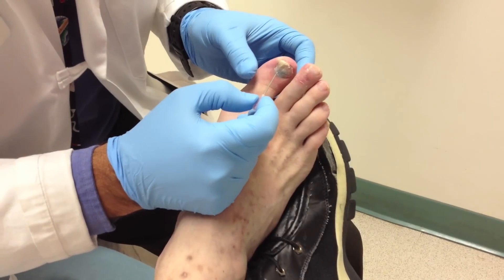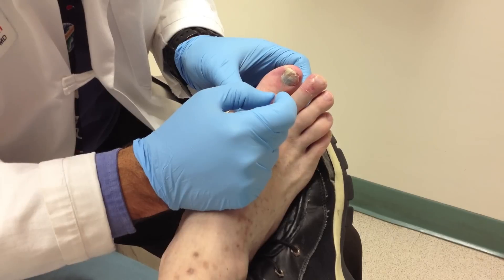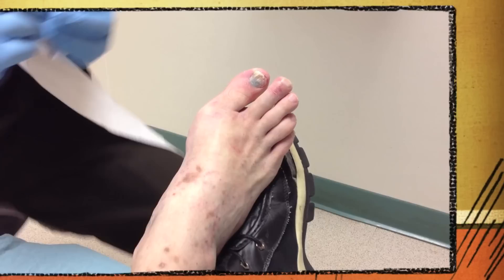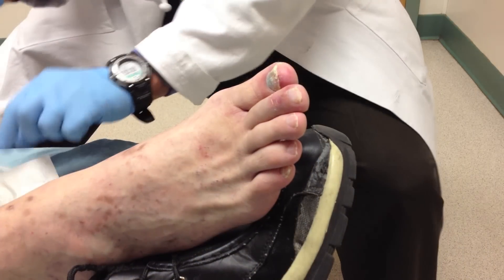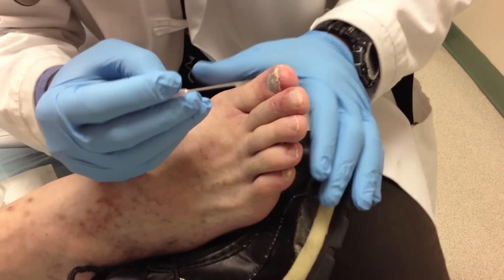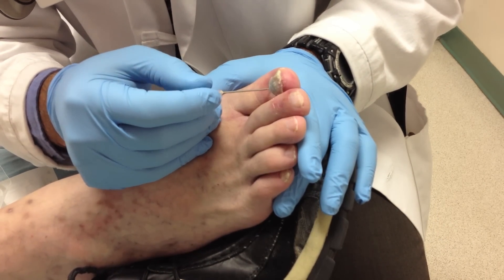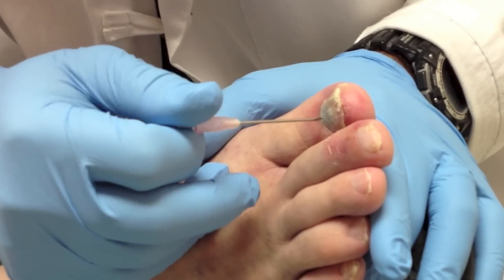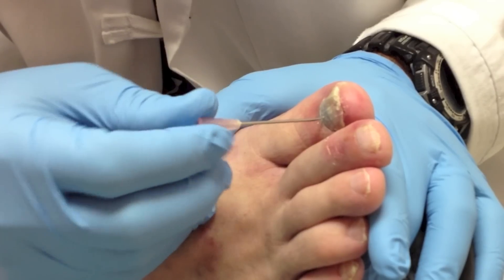All we do is use the needle. Try to stay still, sir. I'm going to try not to hurt you but I'm just putting some pressure right there. So we slowly start rotating through and basically we're just drilling a hole until we get blood.